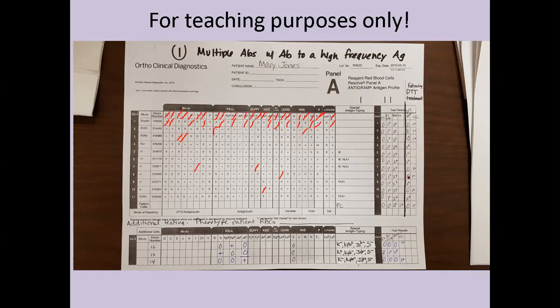Cells 7 and 8 did not react with the patient. We see that S antigen is not present in either of those cells. And then cell 9, S antigen is homozygous. We have a 2+ reaction with our patient, negative with 10, S antigen is absent. And once again, cell 11, homozygous, 2+ reaction. So guess what, folks? That is a perfect pattern match for anti-S.